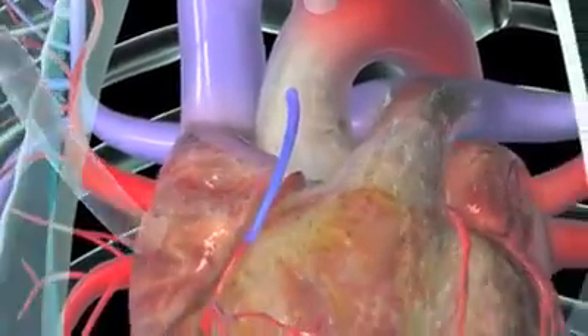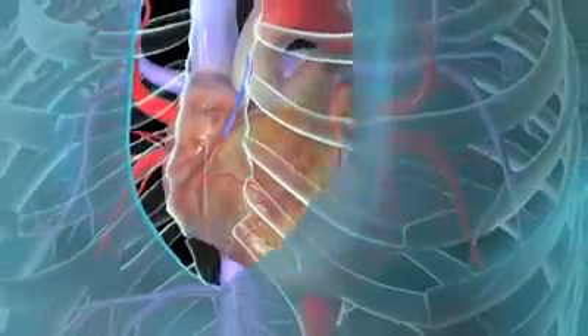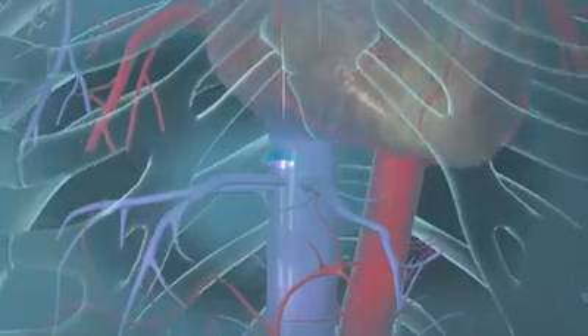Then she'll wire your breastbone back together and stitch or staple your skin closed. She'll put a temporary drainage tube in your skin, just below the incision.